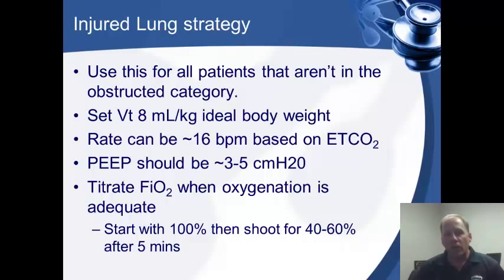All right, next I want to talk about the injured lung strategy, and this is the one that we use for everything else besides the obstructive strategy. This is all your unresponsive patients, your ROSC patients, unresponsive for whatever etiology.